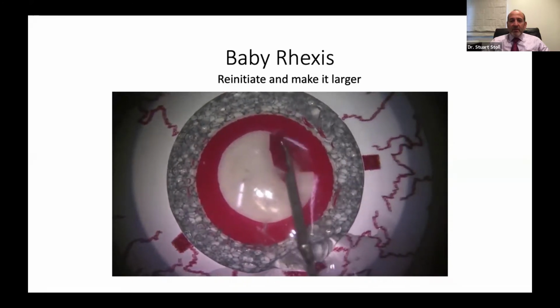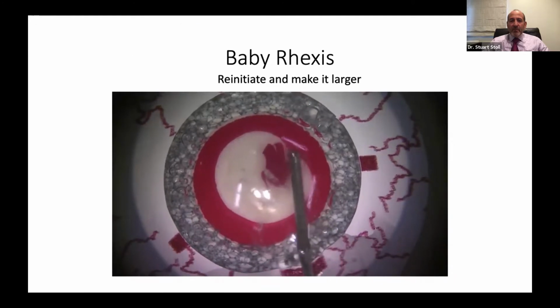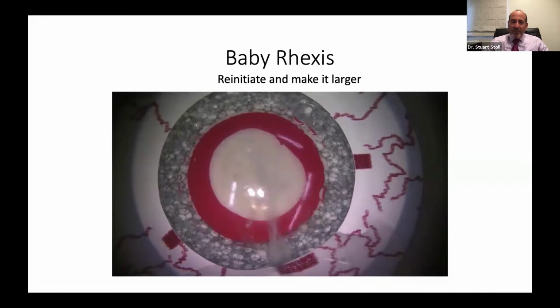The only thing we could have done better here is finish from outside to in. You'll see a little nub at the very end. Watch, right there. So if we'd gone a little bit wider at the end, you always want to finish from outside to in to incorporate all that other stuff in there.